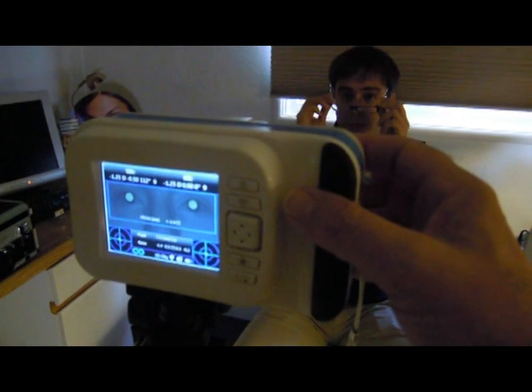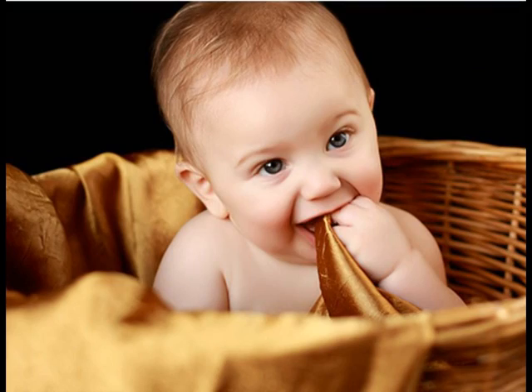You can evaluate any patient without their cooperation. Infants from 2 months old, children, seniors, and any non-cooperative patient can be tested in a few seconds.